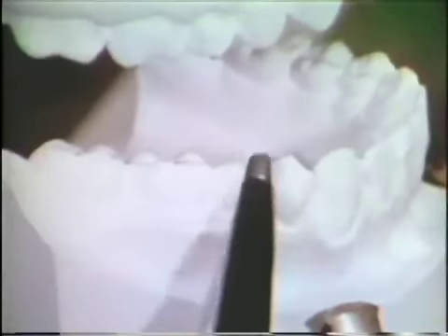A guide for determining this proper direction is illustrated on this model. The direction of a line passing through the red marks on the tips of both cusps of the second bicuspid will be optimal for seeing through most of the interproximal areas. The contact area between the first and second molars has a different orientation, however, paralleling a line through the distal cusps of the first molar. In the mandibular segment, the upper bicuspid tip guide is generally suitable for all interproximal areas, except the first bicuspid-cuspid contact.